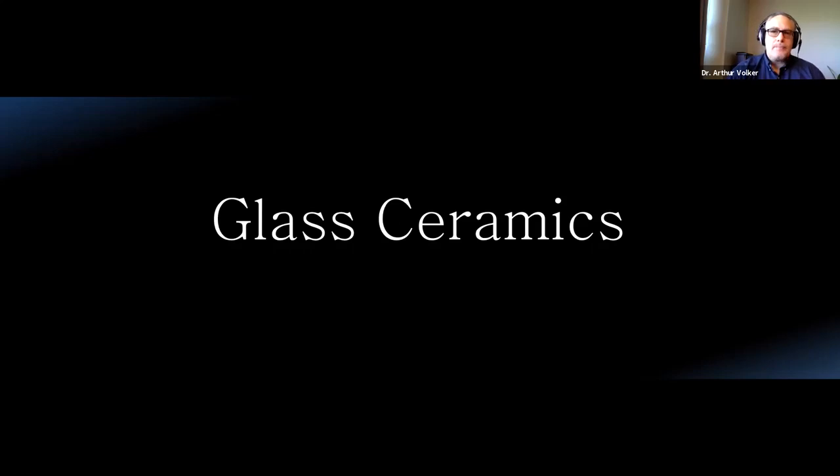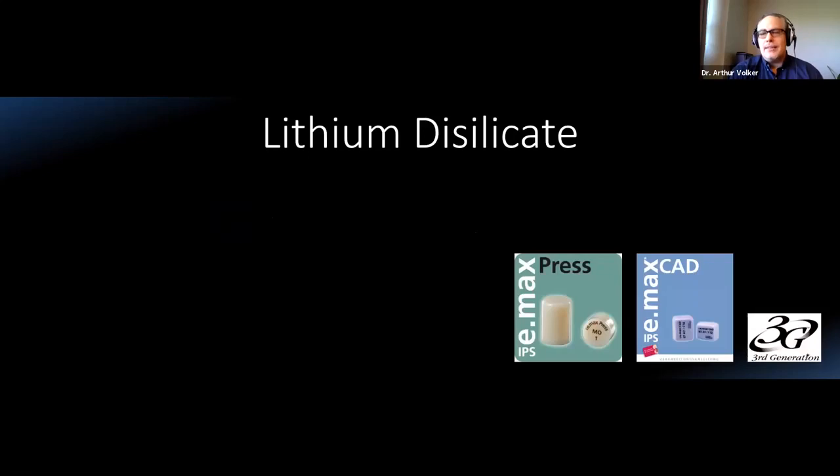And I would say by far, the most commonly used of the glass ceramics, using industry statistics, would probably be some form of lithium disilicate or lithium silicate. There are others still out there, such as people who enjoy using things like leucite reinforced, and that would be something like Empress from Ivoclar Vivadent. It is a fantastic material, absolutely aesthetic. Dr. Hornbrook showed many cases using Empress, but in terms of its usage, it has declined, certainly from our clients, and from what I've seen as a consultant with other laboratories in the past 10 years. The majority of glass ceramic out there today would be lithium disilicate.